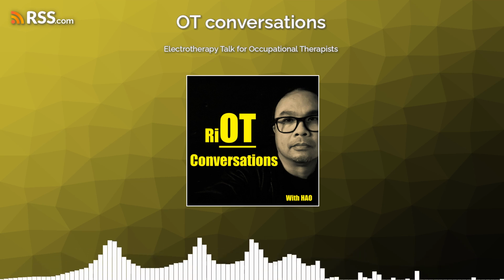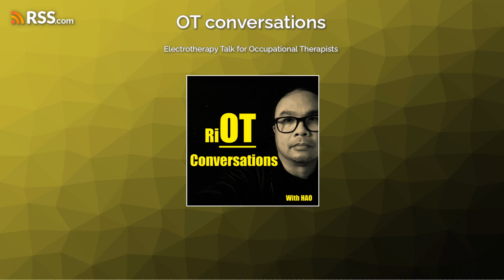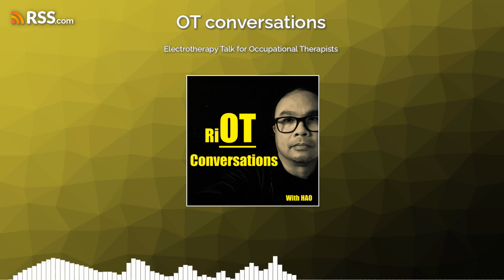Epilepsy, you have to use this with caution for people who have epilepsy because it might induce seizure. Seizure is an increased electrical activity in the brain that is usually facilitated by overstimulation.